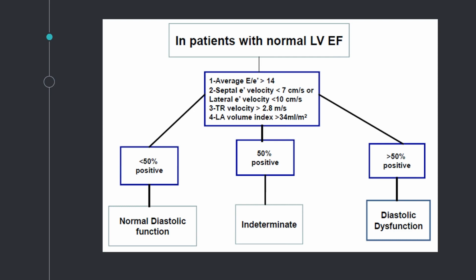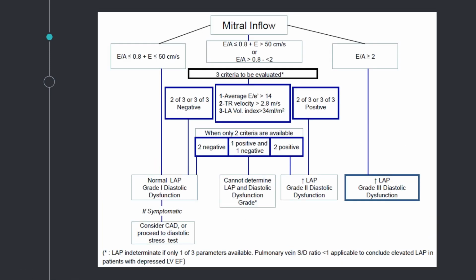So one of the options is to leave it there, and we have done that before, and when people do it that way, studies have shown that around 30 or 40% of patients on a day-to-day basis may have just indeterminate. So some of the proposal is to take the indeterminate one and go into the second table, which is the next one. So that's another way to look at it.